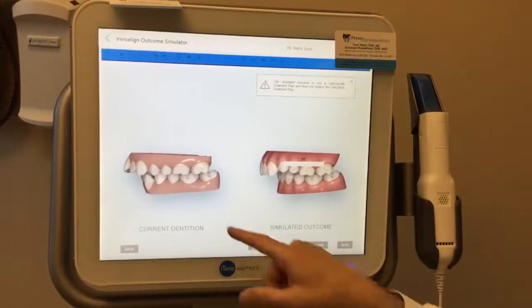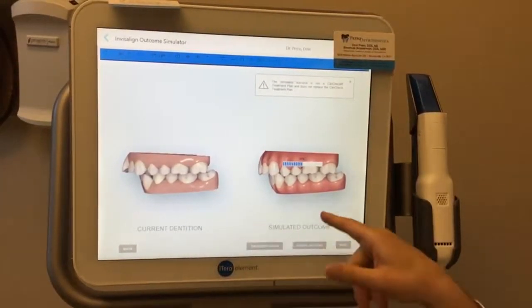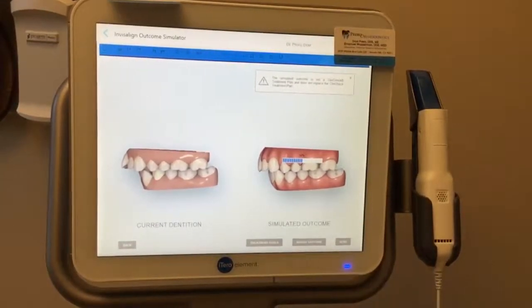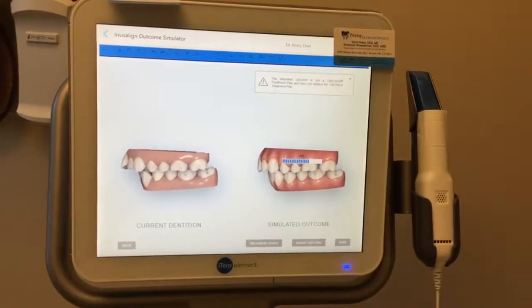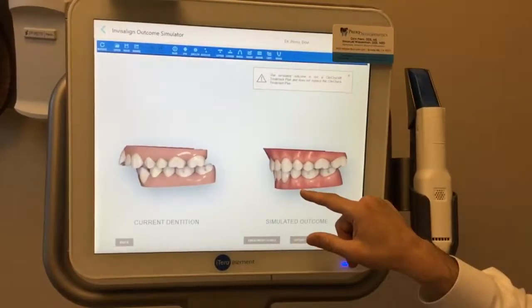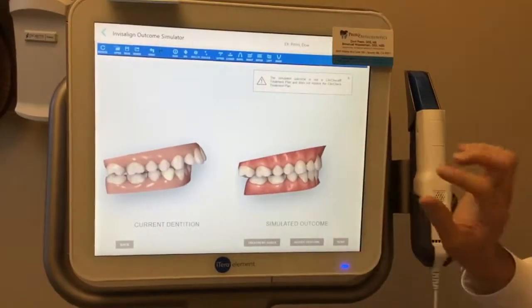And now we'll show mom this overjet got worse because we extracted, and now we're going to get more overjet correction, complete correction, plus profile change with the mandibular advancement. And now mom can see what we've done. And now I haven't adjusted this.